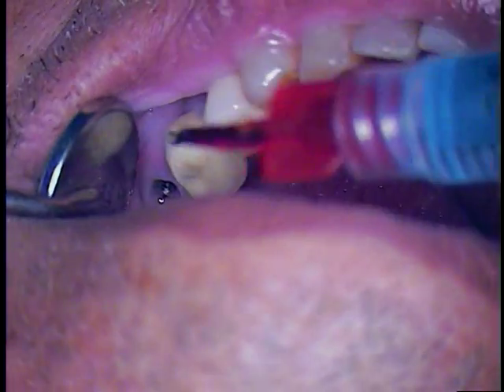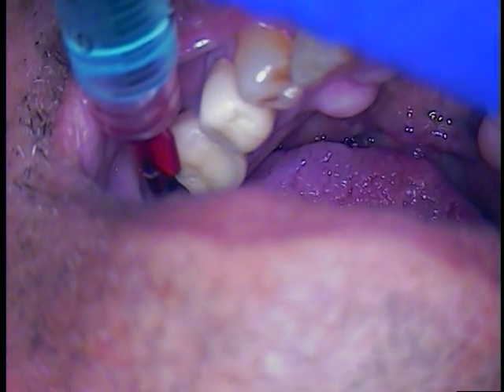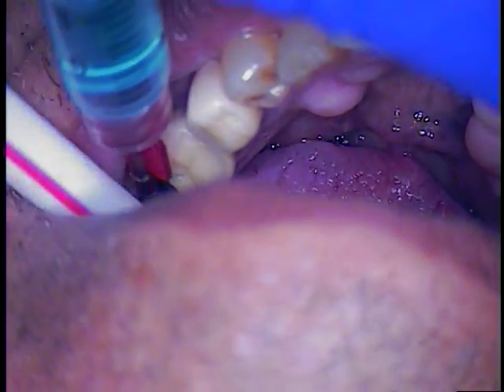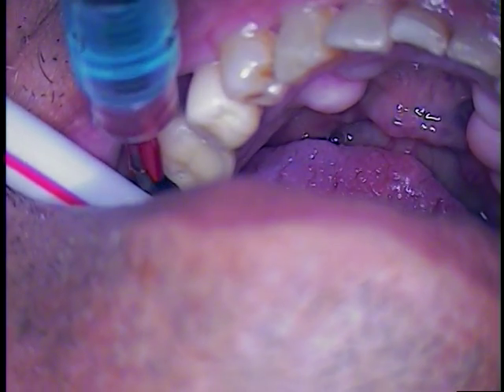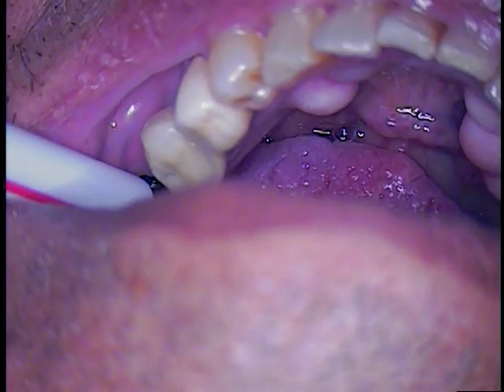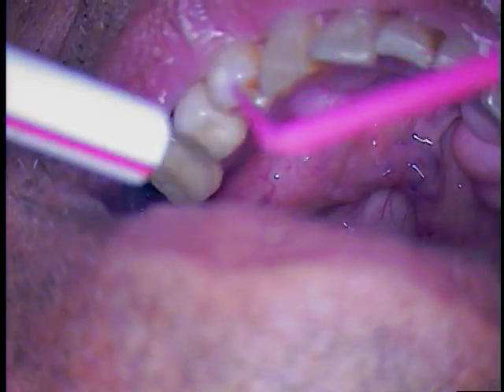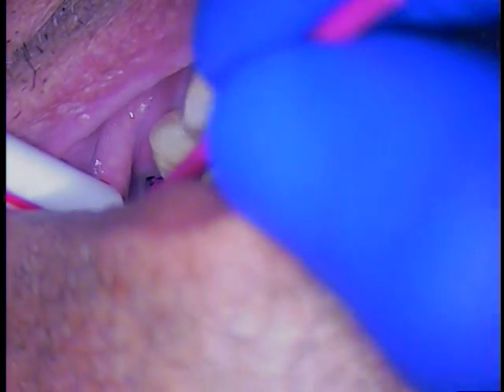This time we're going to use a smaller micro brush, and we'll fill that again and clean it thoroughly again. We'll fill that up, suction it a little bit. Anything in there that's loose will float up to the top — micro brush — and then back in there.